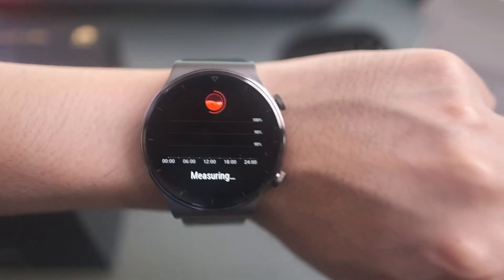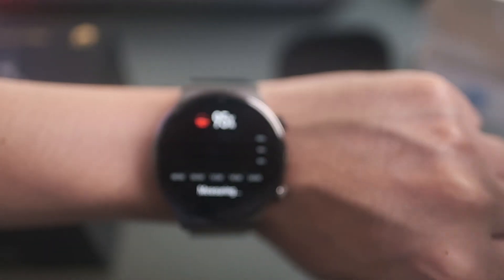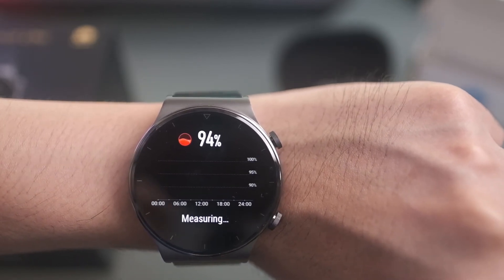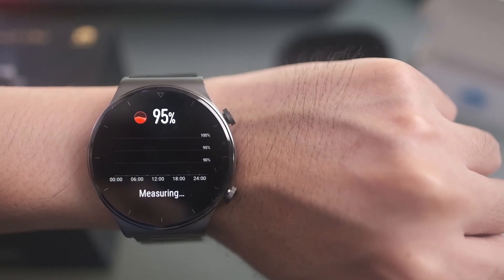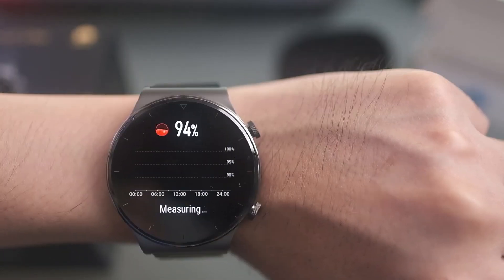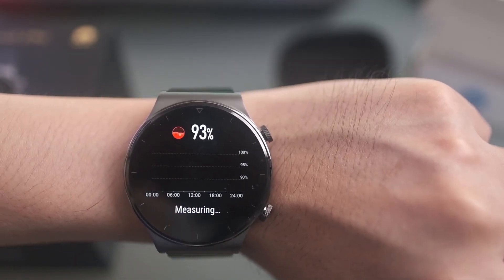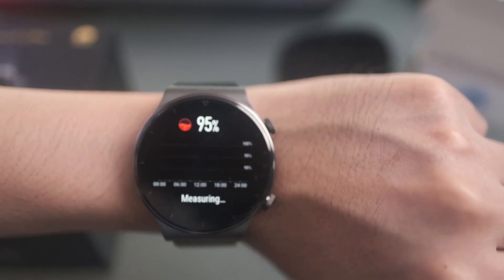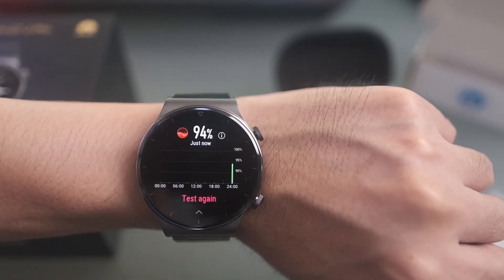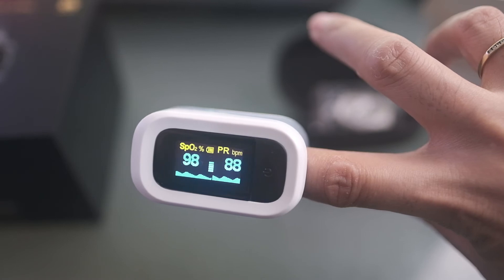On the Huawei GT2 Pro it's reading 94%, while it's still not finished. The pulse oximeter reads 98%. Once done, the final result on the Huawei GT2 Pro is 94%, compared to 98% on the pulse oximeter.